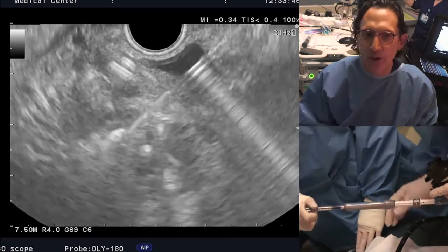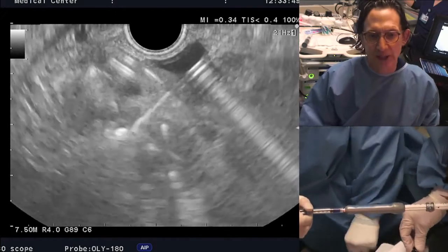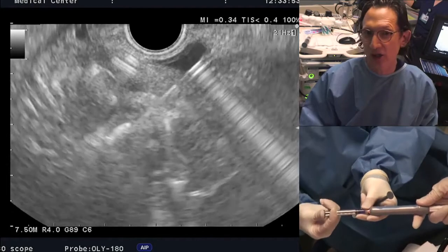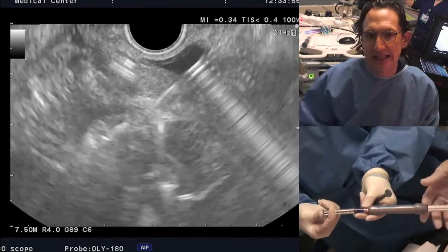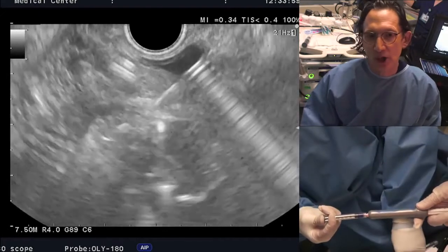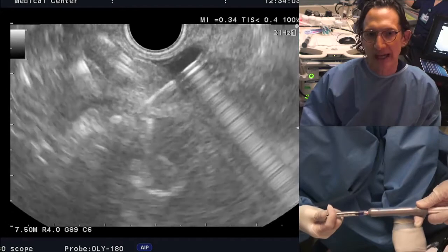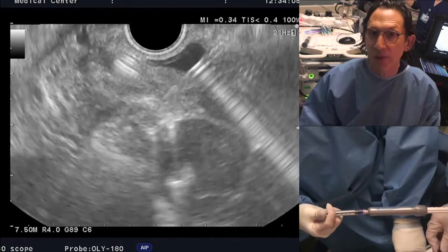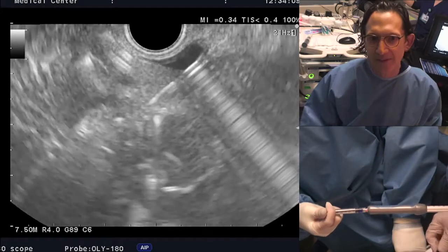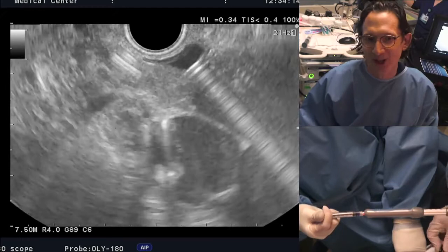So he is the first to describe this treatment, of course, but he's also the first to do biliary stent drainage, watching the radiologists place percutaneous drains. And he's the first to start using the glide wires, hydrophilic coated wires, which radiologists were using routinely. So we've benefited hugely from the prior experience of the radiologists.